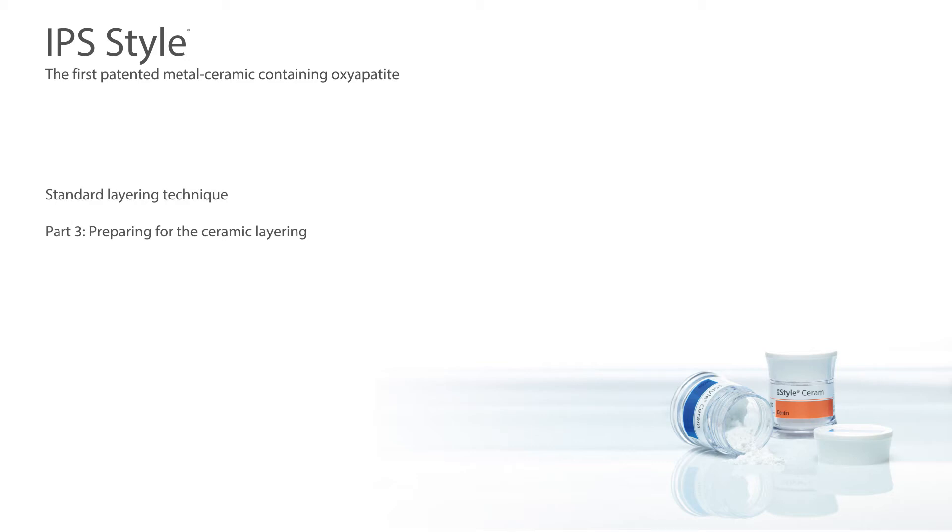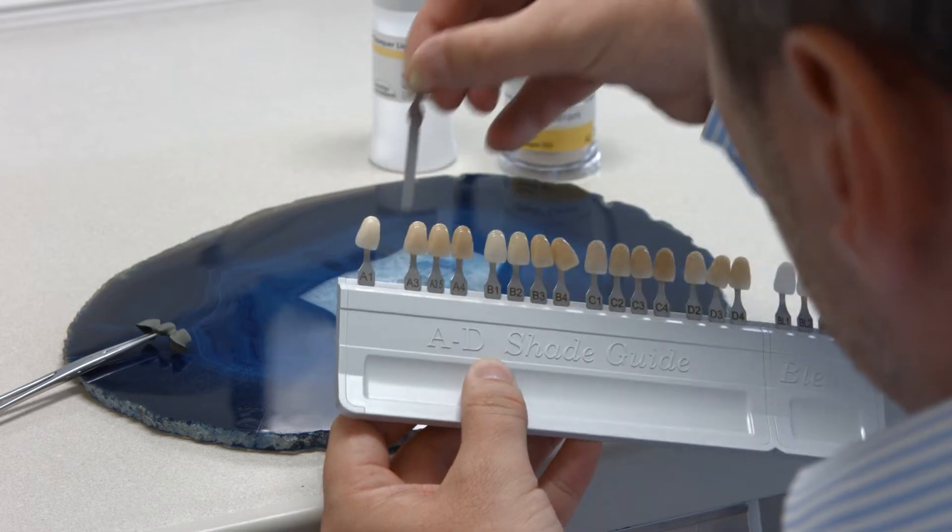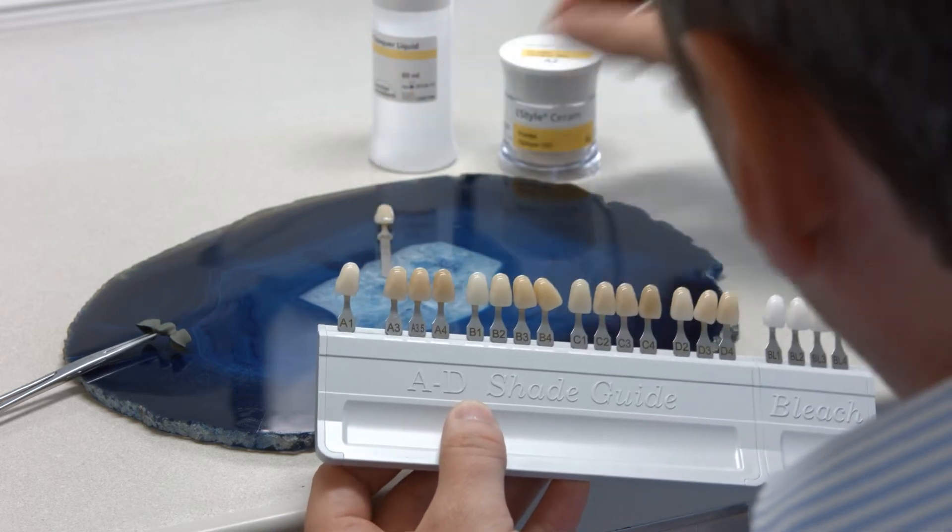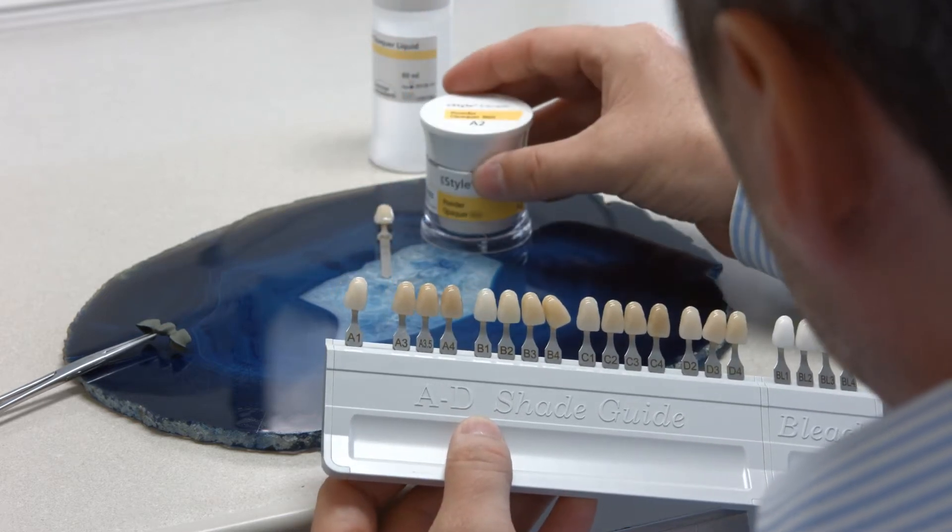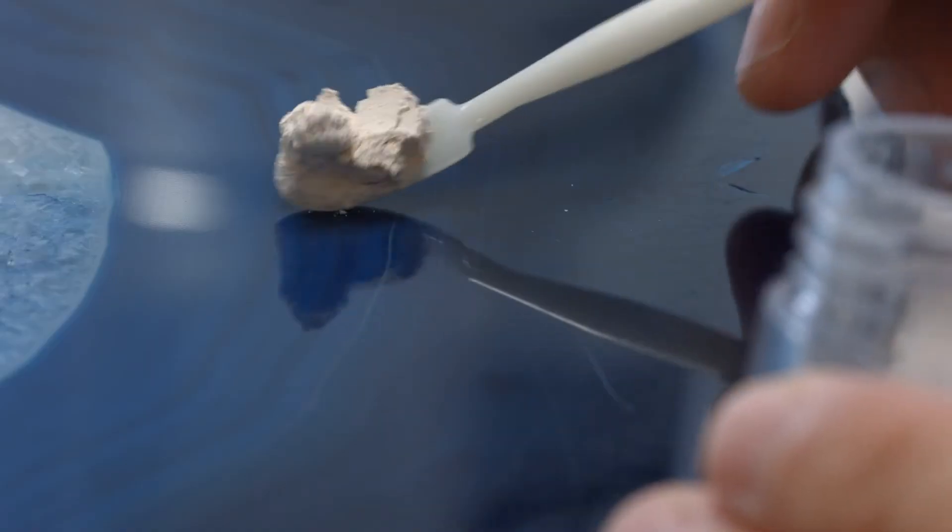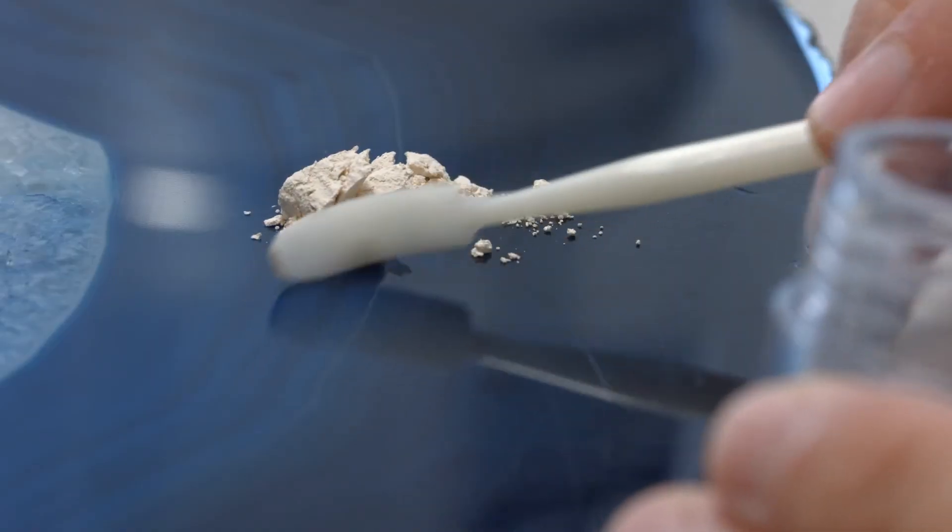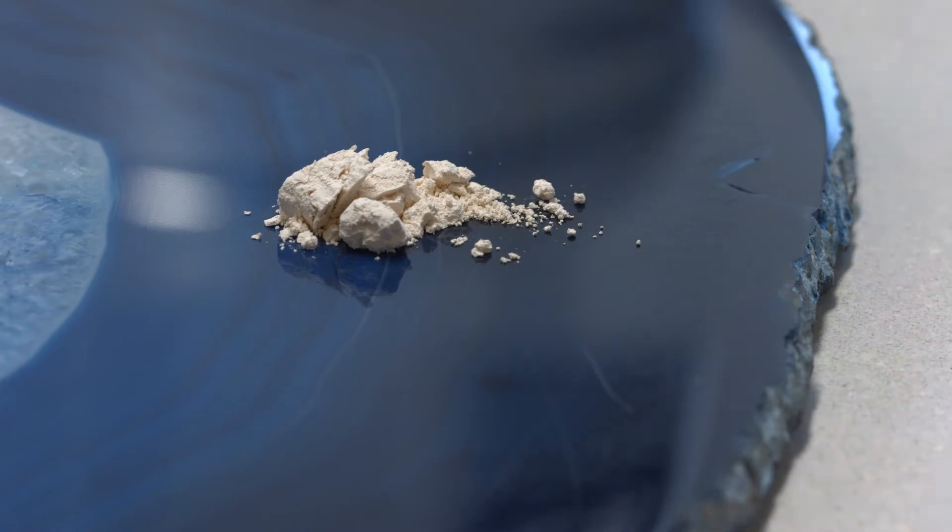Part 3 describes the preparation necessary for the ceramic layering. Select the suitable IPS style ceram powder opaquer in accordance with the required tooth shade and mix it with some IPS powder opaquer liquid on a mixing plate until the desired consistency is obtained.